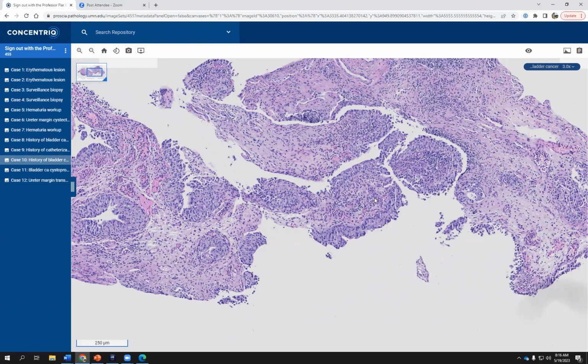Dysplasia, by definition, means there is a mutation, and so there is a neoplastic transformation. When we use the term atypia, we are saying that we are not sure whether this is reactive or whether this is a neoplastic condition. But when you use the term dysplasia, you're committing to a neoplastic condition, and we cannot be sure of that in many settings. So I would recommend not using the term dysplasia at all, right?